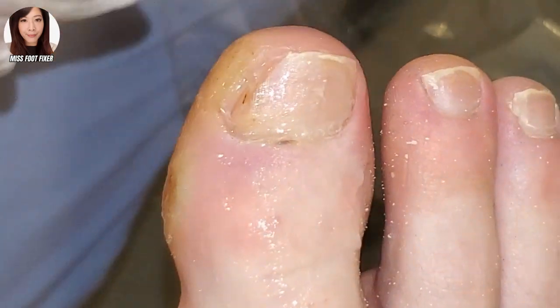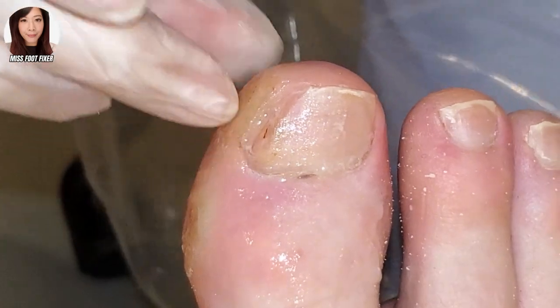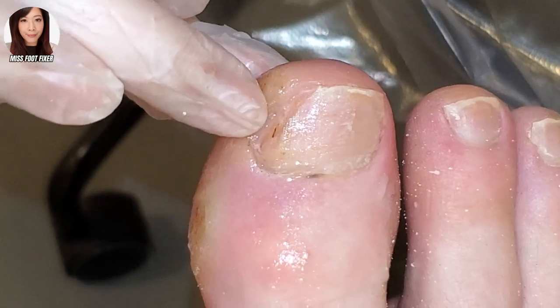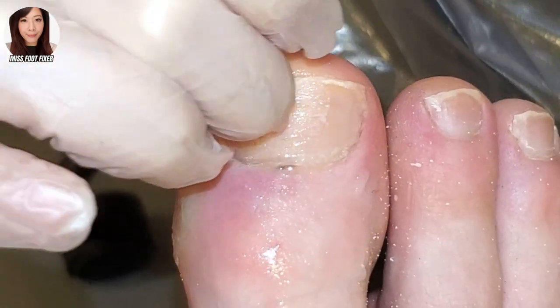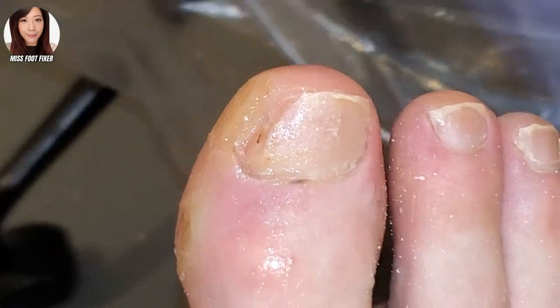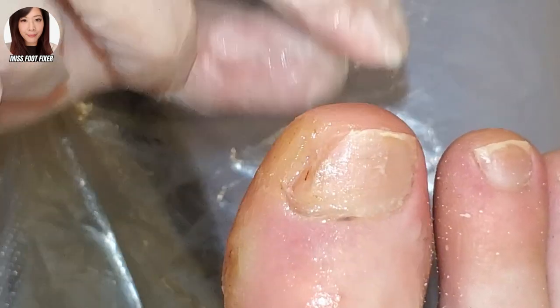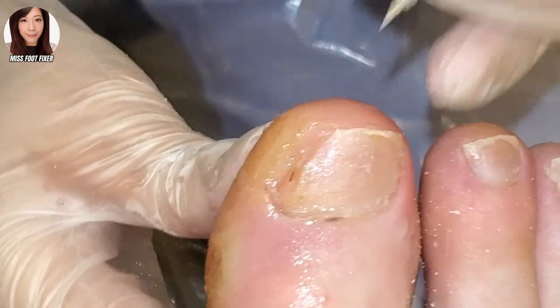It looks a lot cleaner — it looks fantastic. There's a little bit of nail bed damage. Your nail bed should be nice and straight, and that is the pink bit in the middle. But the nail bed on top here is missing, and what we have is really hard, dead tissue. So when the nail plate attaches, it will really only attach to this bit here, and then it will start to lift — which is why you have this corner here that's white. You have only free edge. So we're just going to follow that back.